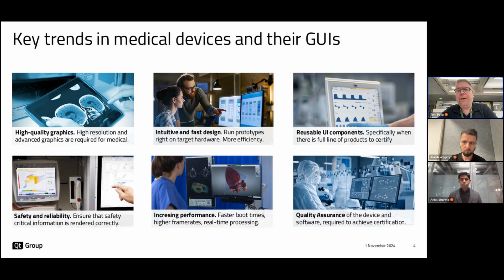It actually starts to make sense. Many of these applications in medical are quite complex, and if you have something certified, something that has already passed all the tests and so forth, you are able to save a ton of time by reusing those designs and those components that have already been approved.